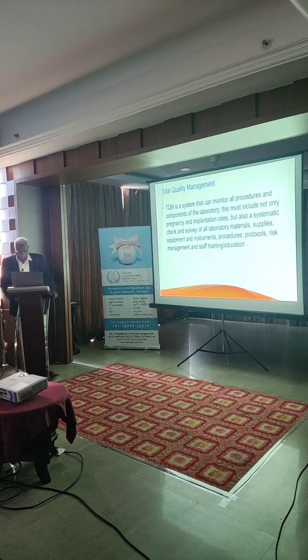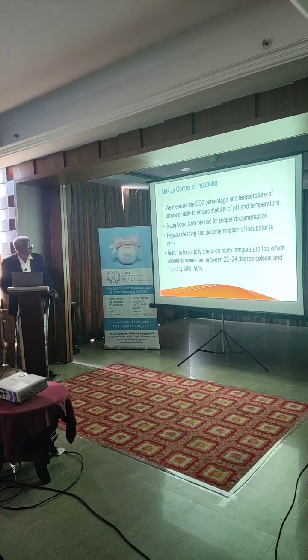Now, of course, most laboratories have to have quality control methods. We are dealing with so many instruments and so many protocols, and unless you do a thorough check of all the laboratory equipment, particularly the incubators, the laminar flow, the clean system, all that, and keep proper documentation of whatever you do.